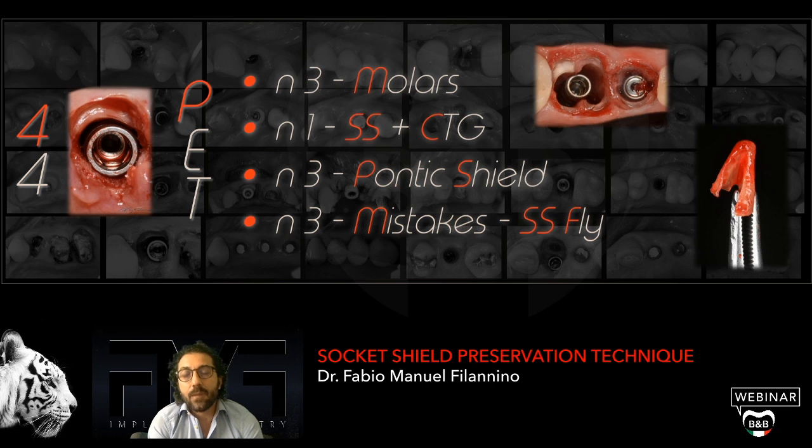So one mistake was not cleaning the apical region very well, and we'll see that later. And then I made another mistake, which was not cutting perfectly in the mesial distal aspect of the root. So when I went to extract the lingual part of the root, actually I removed the whole root.